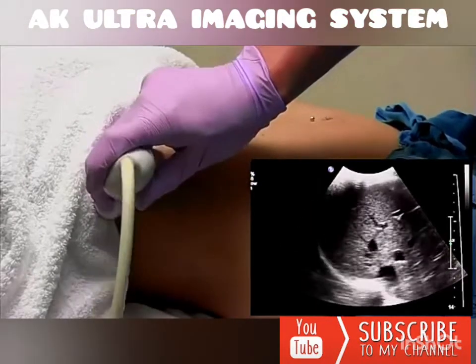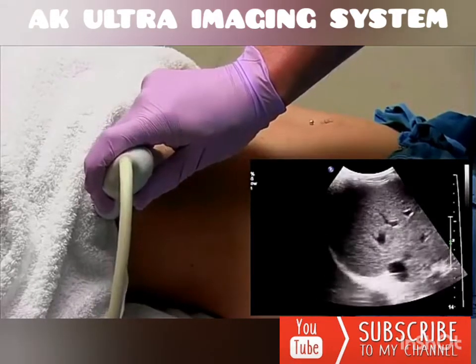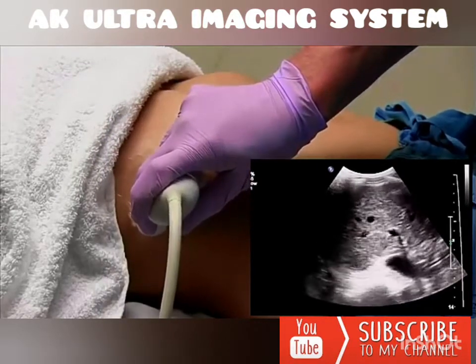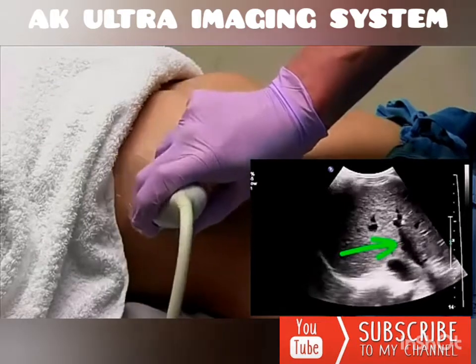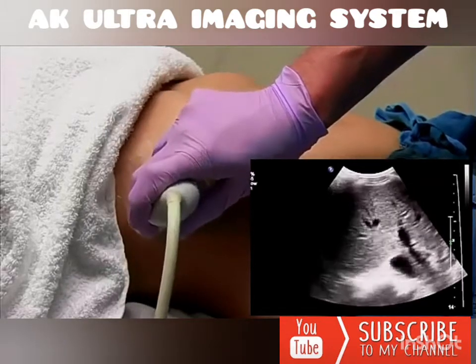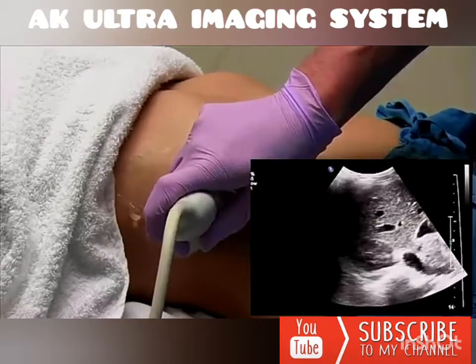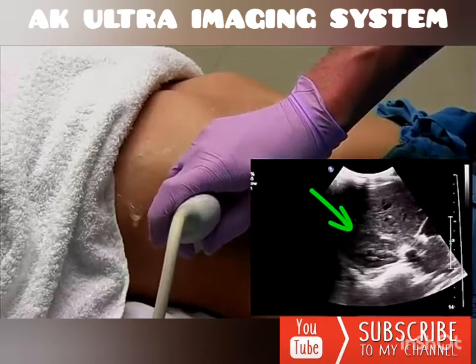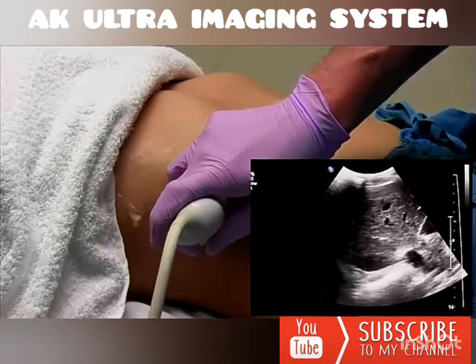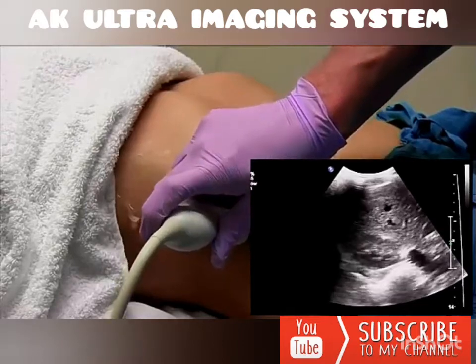As you're doing this, you're still getting those same pictures: one at the dome of the right lobe, one at the hepatic veins, and then as you jump down, you'll get a picture of the main portal vein. You can also see the main portal from this window split into right anterior and right posterior portal vein. At the last rib space, you should start to see the upper pole of the kidney against the liver surface. From here you can judge the echogenicity of the liver and the kidney.